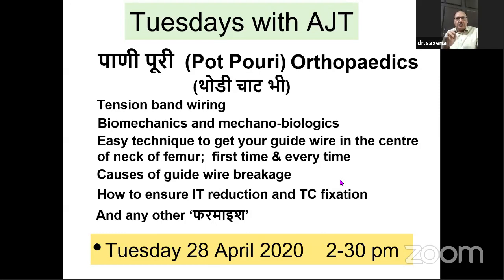Now, as far as micromobility is concerned, axial micromobility, that is along the axis of the diaphysis or the long bone, is beneficial, whereas translational or side-to-side mobility is dangerous. So care should be taken that when you distract and compress, it should be along the axis of the bone. And that leads to better alignment and better healing.